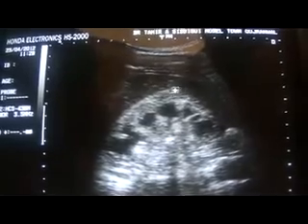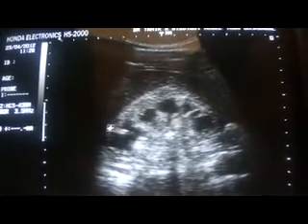This one at the upper mid region, I have measured that. This is the upper pole, this is the lower pole, this is the mid region with calculus in the renal pelvis.